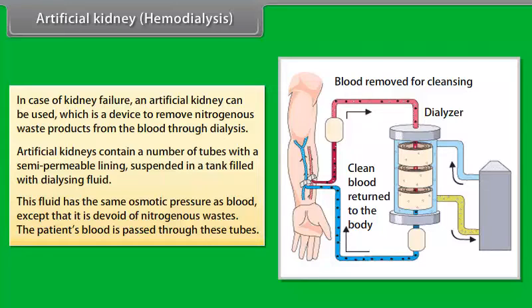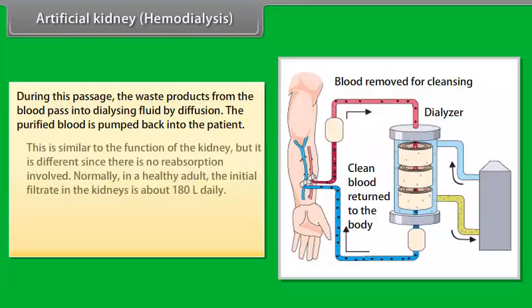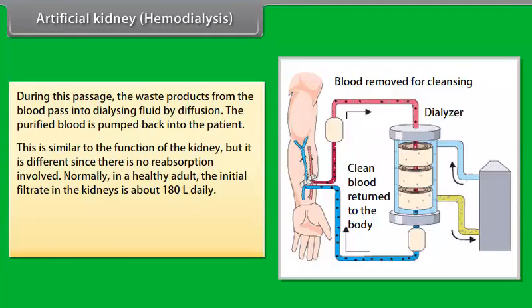The patient's blood is passed through these tubes. During this passage, the waste products from the blood pass into dialysing fluid by diffusion. The purified blood is pumped back into the patient. This is similar to the function of the kidney, but it is different since there is no reabsorption involved.